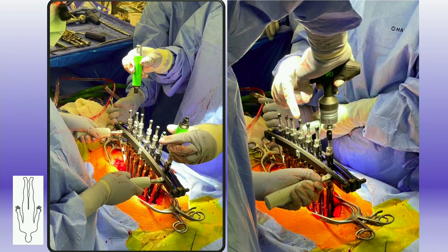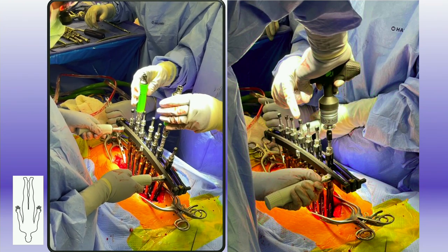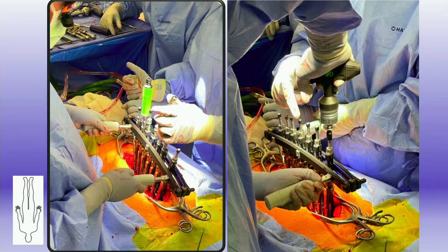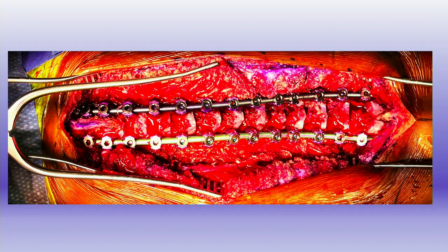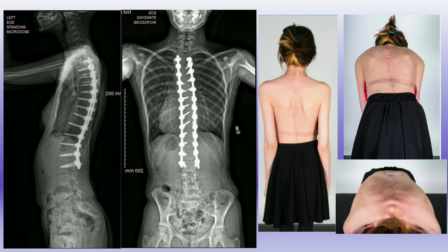One of the most dangerous parts of the case has been handing the final tightener to my assistant, so now we just final tighten right over the towers with the caps in there — we don't have to introduce any instruments into the open spinal canal. Rarely we do compression-distraction techniques or some in situ bending. Looking at the rib cage and trunk shift post-op, you can see improvement. Shoulders aren't perfect — perhaps going one more level up could get the shoulders a little more level — but clinically she looks pretty level and the rib hump is gone with no thoracoplasty.